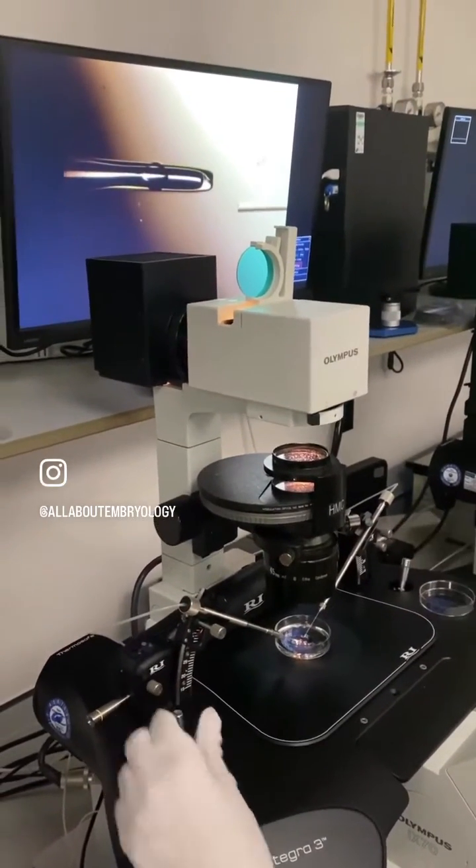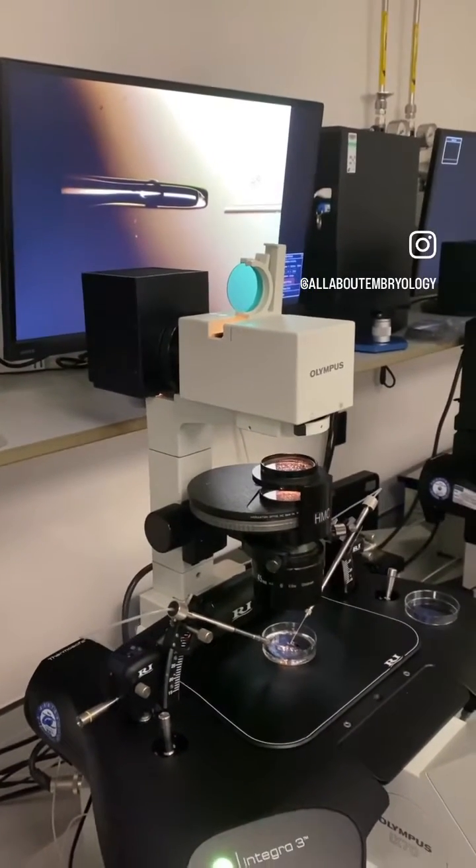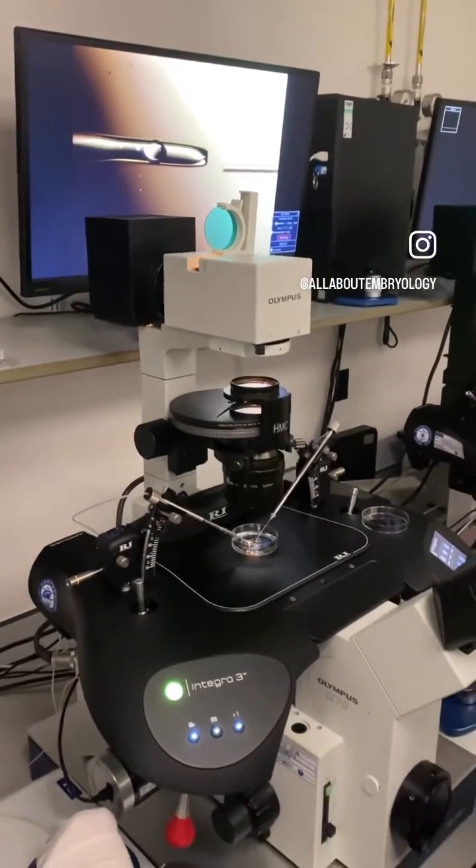To perform the biopsy, the embryologist uses a holding pipette on the left which secures the blastocyst, and a smaller biopsy pipette on the right to aspirate the cells.